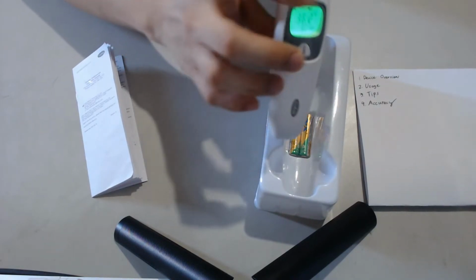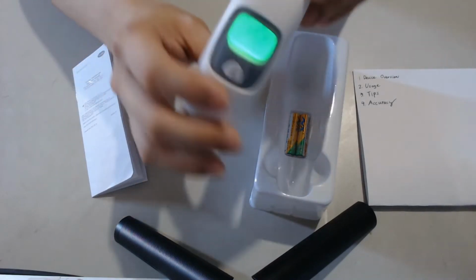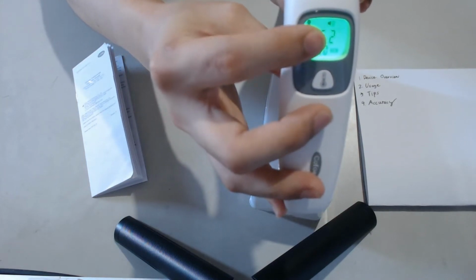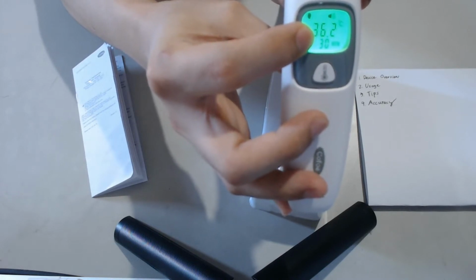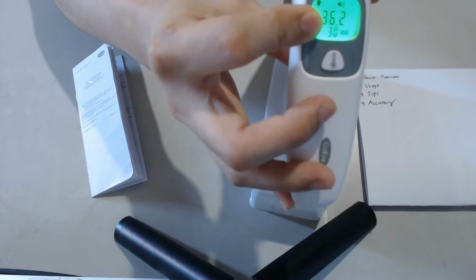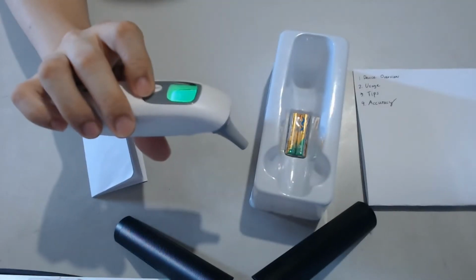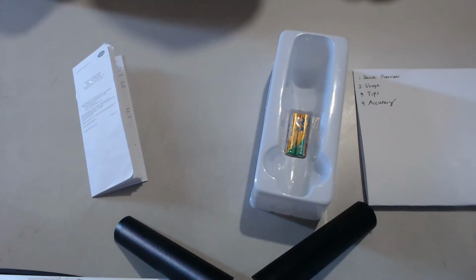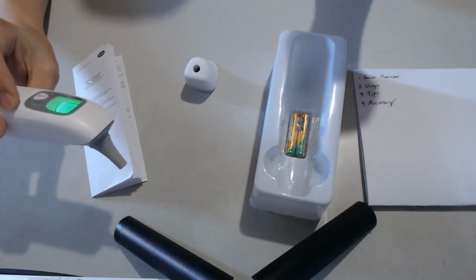And you see, the display is green, and look at this. There's this icon here. It's not clear here, but it is a head, a person's head. If I remove this, well, I'm going to measure my ear first. You hear the beep, right? That's a sign that the temperature is measured.